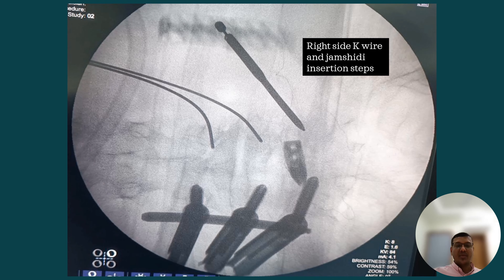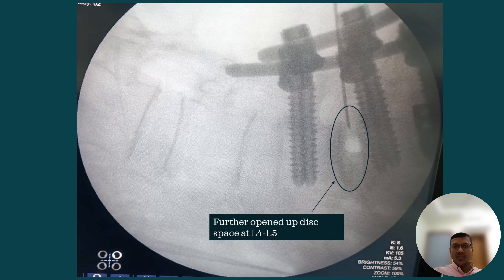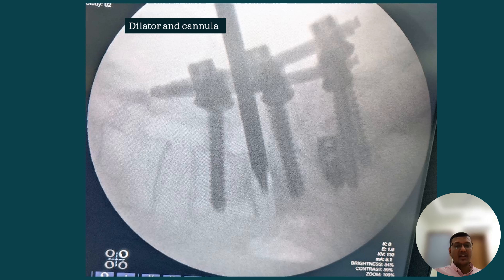At L4-5, the posterior space was still narrow and our dilator was not able to pass through it, so we decided to put the MIS pedicle screws and distract the space first. This was the learning lesson for us: in severely narrowed disc spaces we should put the MIS pedicle screws first and reduce the listhesis, so we can do the disc work and cage insertion without unnecessary struggle.